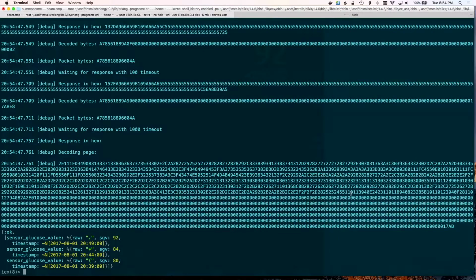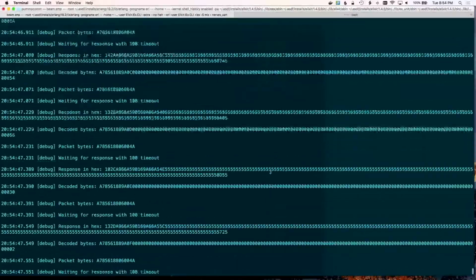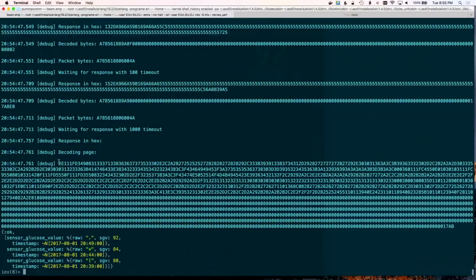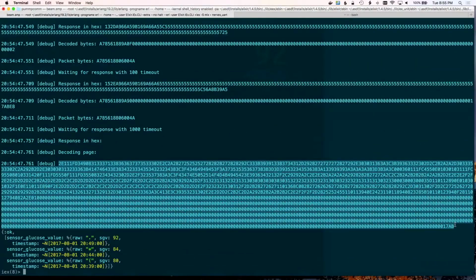All right, so it went, and you can kind of see some of the logging that happened here. It's pulling in, each one of these pieces of information is one packet, and 16 of those make up a 1024 byte page, and this is what a page looks like. It's basically just a bunch of events written sequentially, followed by a CRC at the end.